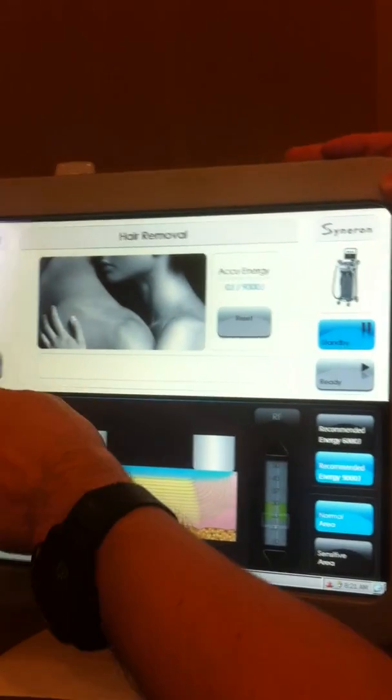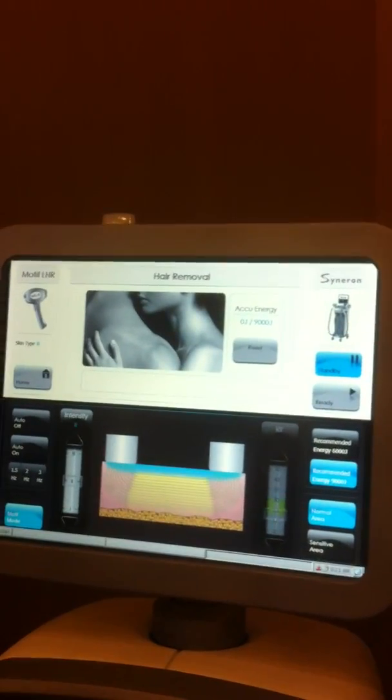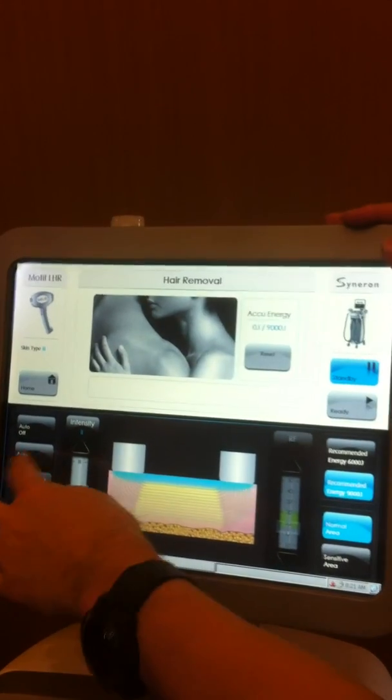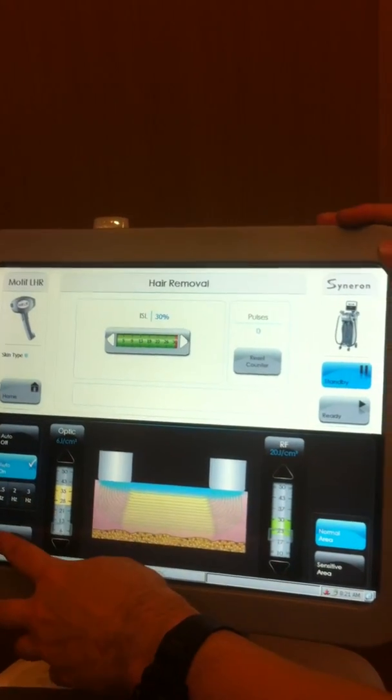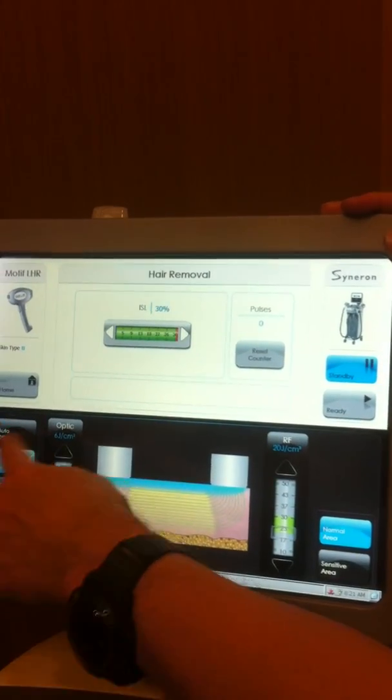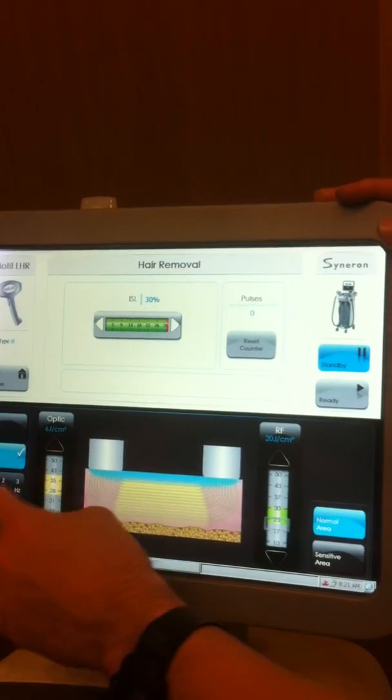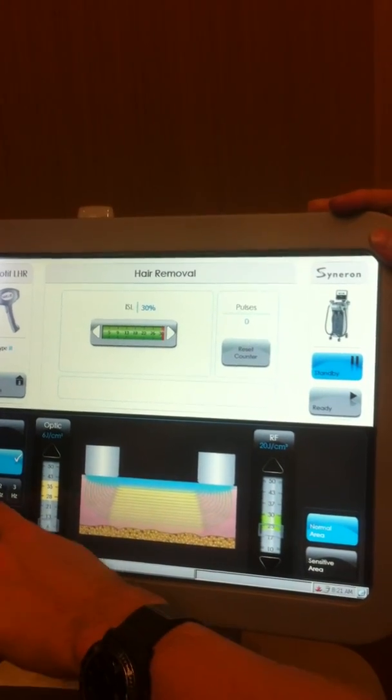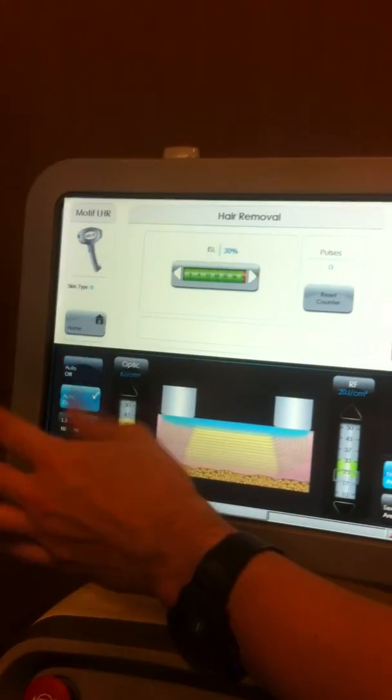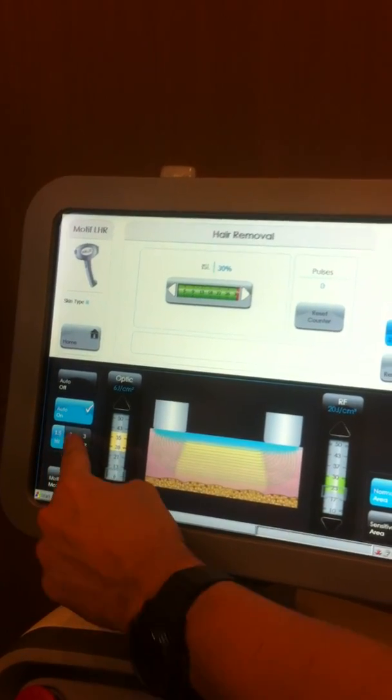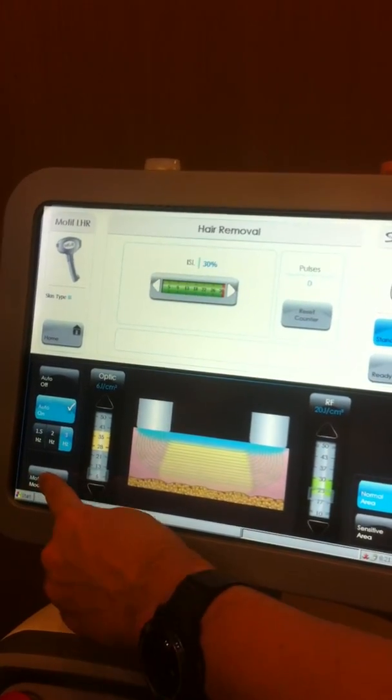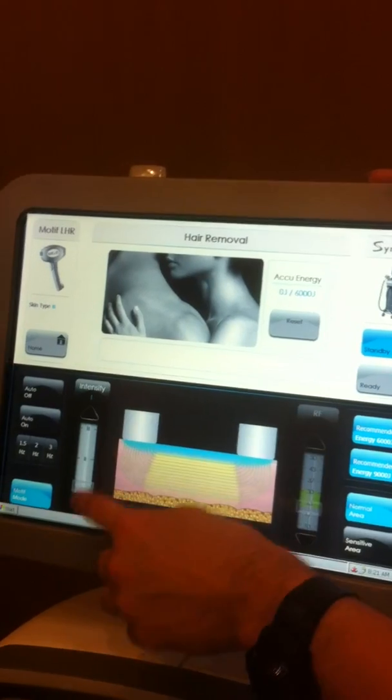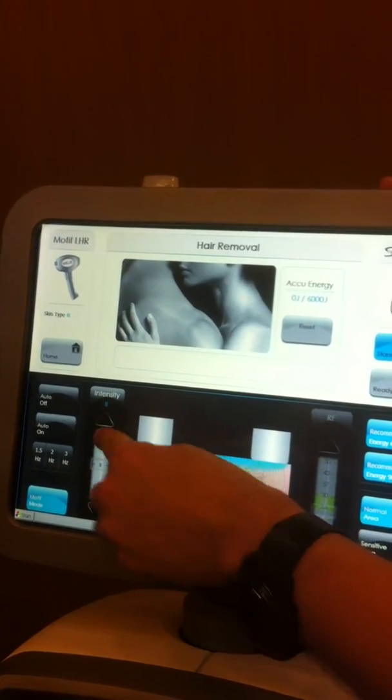If you want to switch back. How come it's at 1.5, 2 or 3 hertz there? Because in motif mode, isn't it 10 hertz? Yeah, but it's not in motif mode right now. So this is just regular LHR mode and when auto's on, it's 1 hertz, then I have 1.5, 2 and 3. And then when I hit motif mode, you'll see the widget changes and then I get intensity 1, 2 and 3.